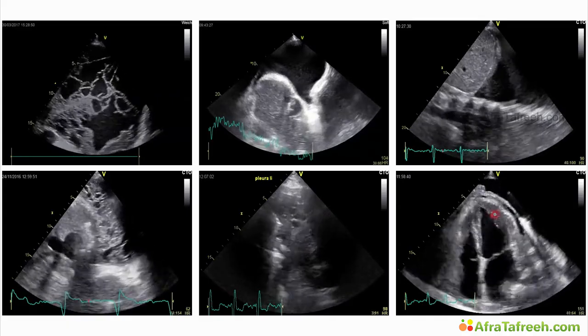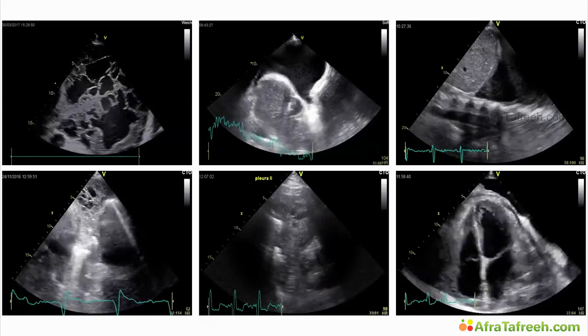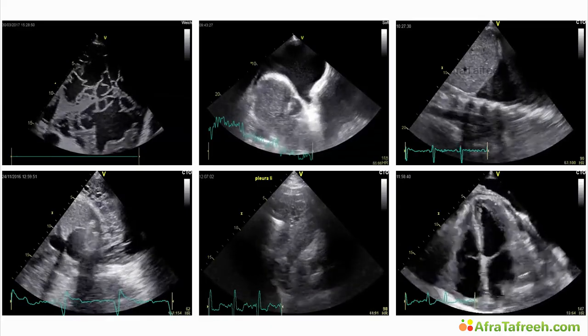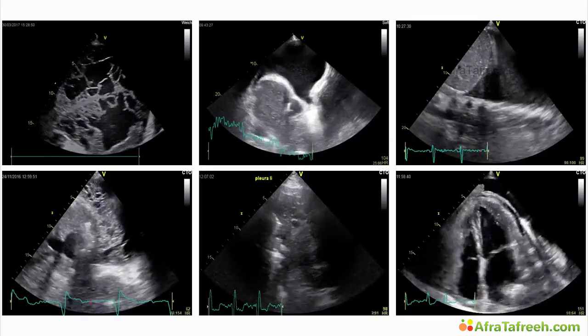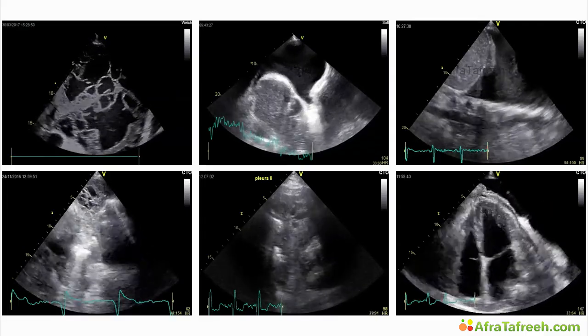And this image is just to show you that we can even image a pleural effusion if we perform a 4-chamber view, because it is located lateral to the heart. Remember, the position of the heart is in close proximity to the pleura.